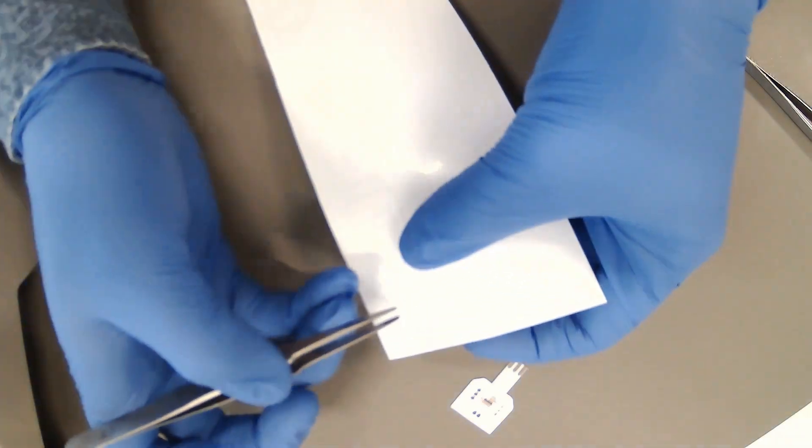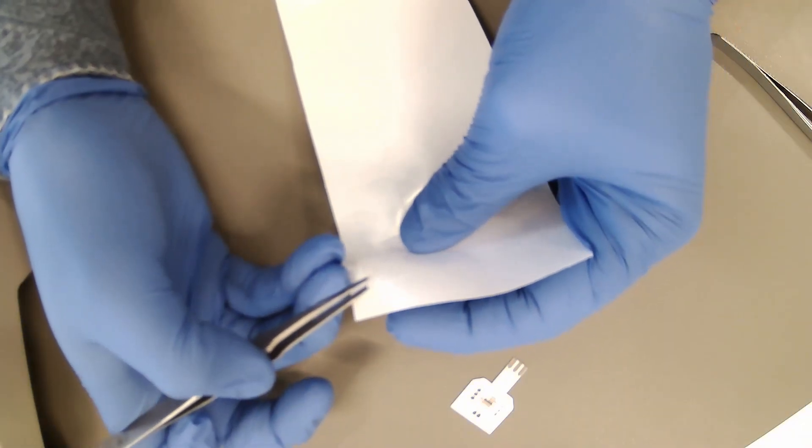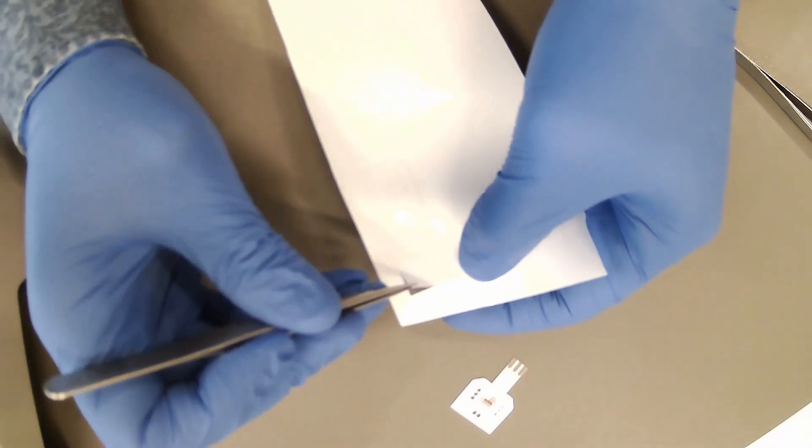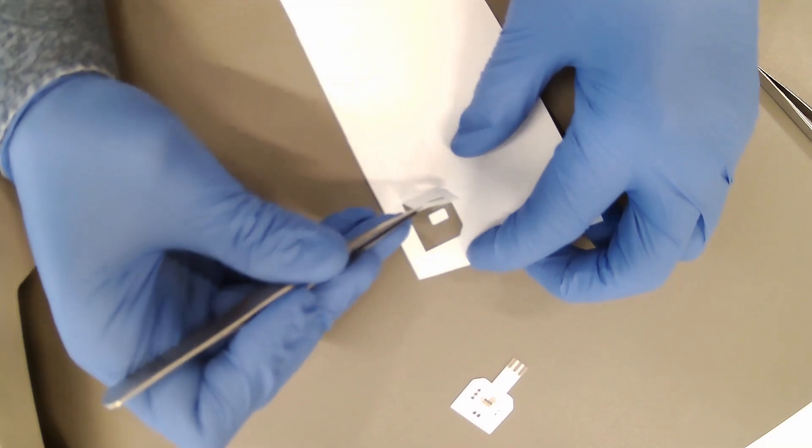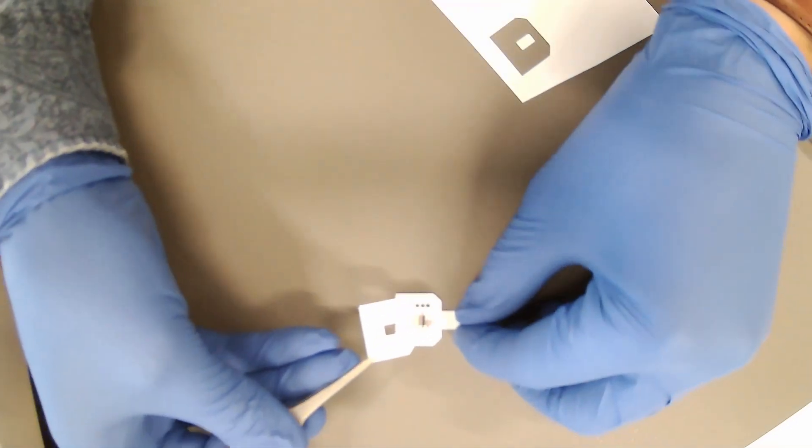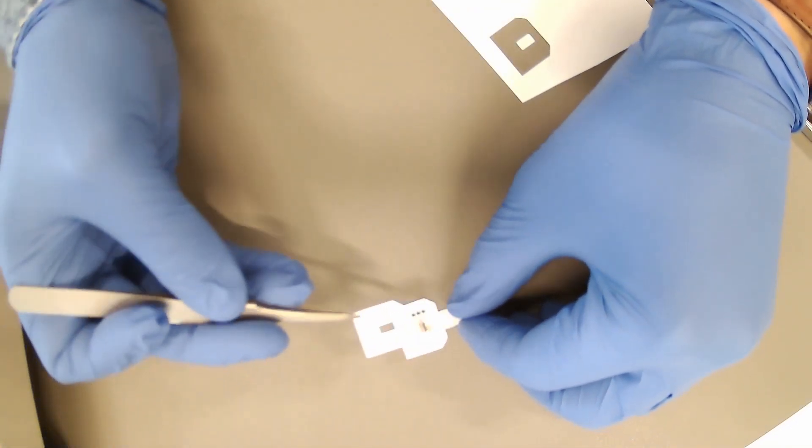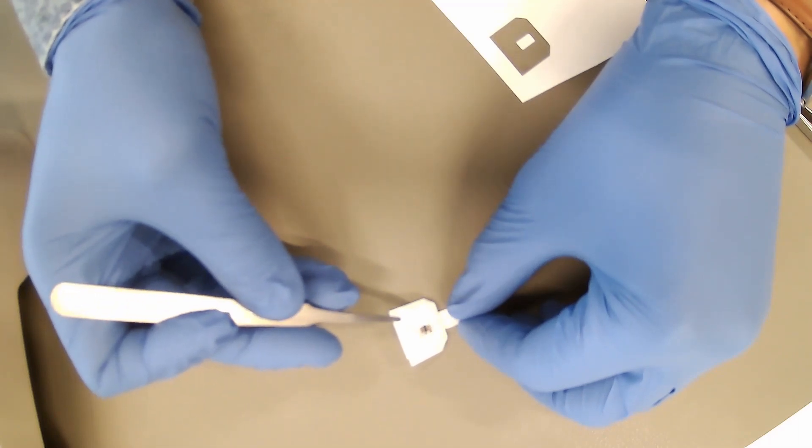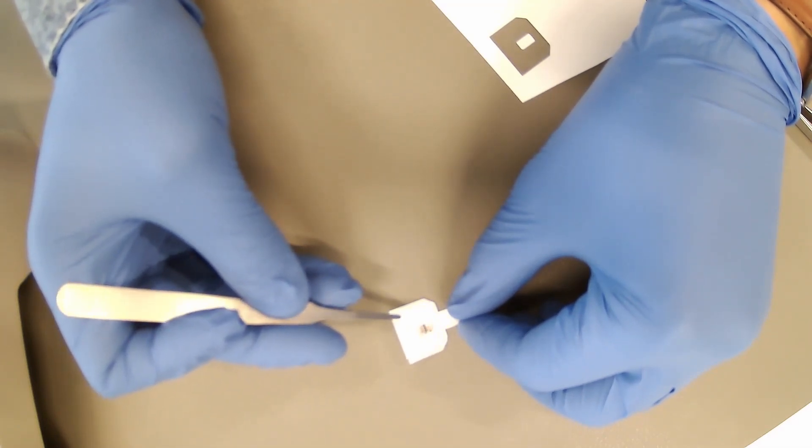The third layer is the micro reservoir. In this step, the adhesive is peeled off and the layer is attached to the previous layers. This layer is used to control the volume of the sweat sample to be measured on the sensing area of the SPE. It will measure a volume of up to 15 microlitres.